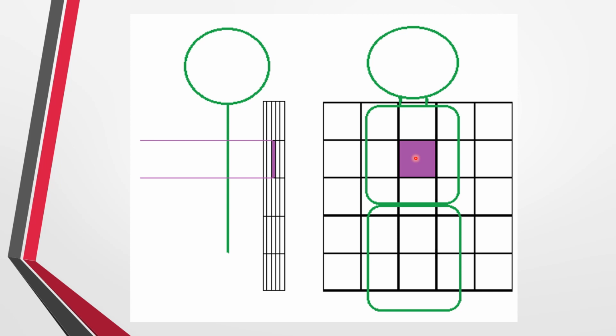When the matrix of an image is displayed on a monitor, we can call it a pixel at that point. So the monitor displays pixels. Pixels is going to be utilized in text in different ways. They're going to use the term pixels for just describing a cell of a matrix in any way. So for my purposes, when we're talking about the matrix, it's a cell. When it's being displayed, it's a pixel.